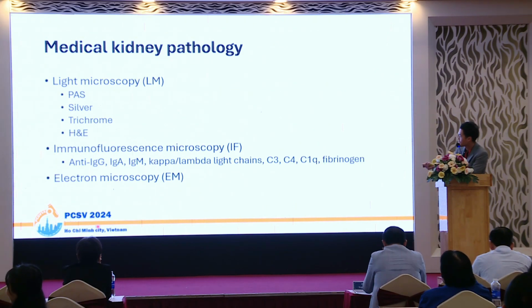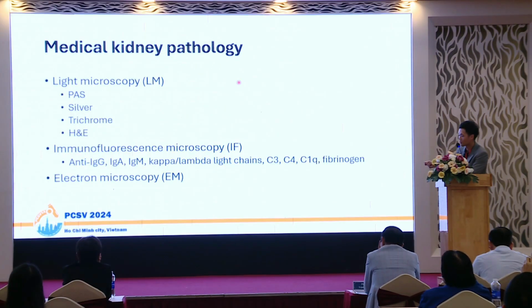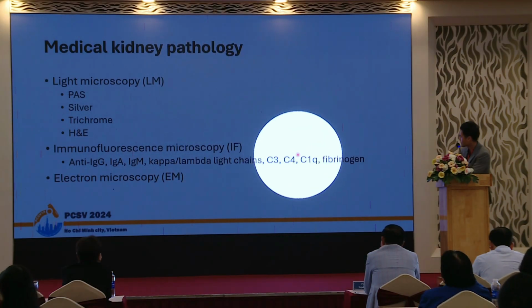In light microscopy, as I said, I use these 4 stains, and in immunofluorescence, I stain heavy chains and light chains for immunoglobulin, and complements and others.